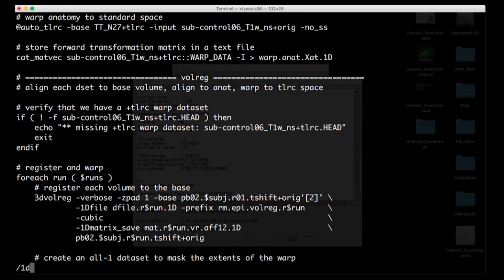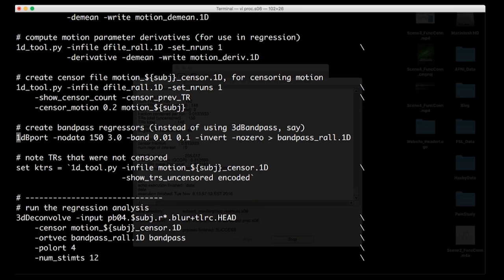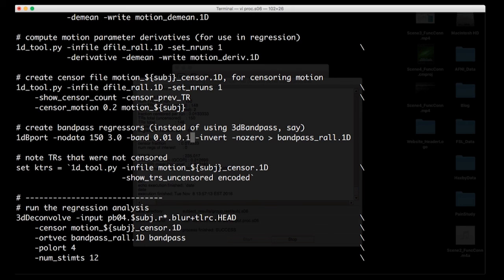But there's one thing I want to point your attention to. So this 1dBport tool, this is a bandpass. So if you're familiar with high pass filtering and low pass filtering, essentially what that does is remove really high frequencies and really low frequencies, and especially low frequencies associated with things like, you know, breathing, slow scanner drift, heart rate, things like that. In general, for resting state analysis, we're interested in frequencies between about 0.01 hertz to 0.1 hertz. So 1dBport is going to take all the parameters for our data, as in how many TRs, what the TR is, and it's going to bandpass filter between 0.01 and 0.1.